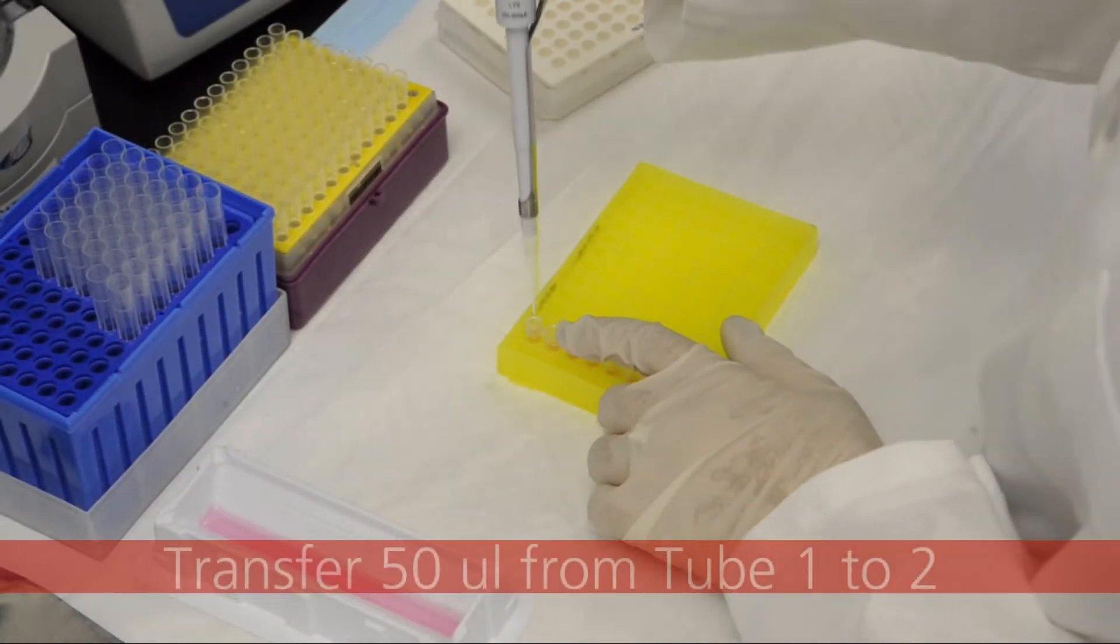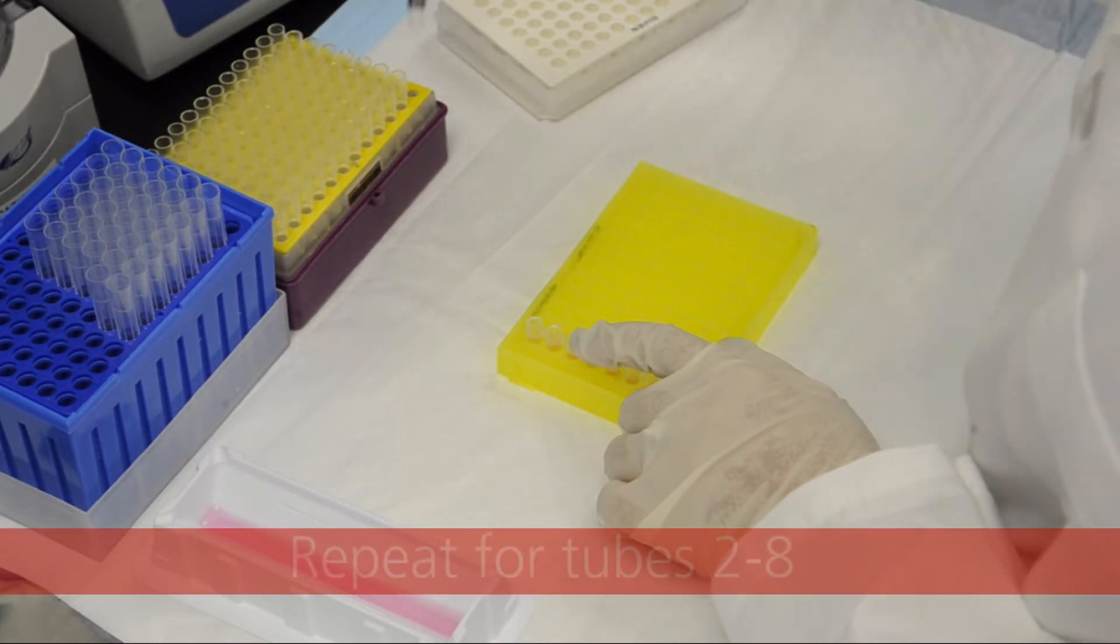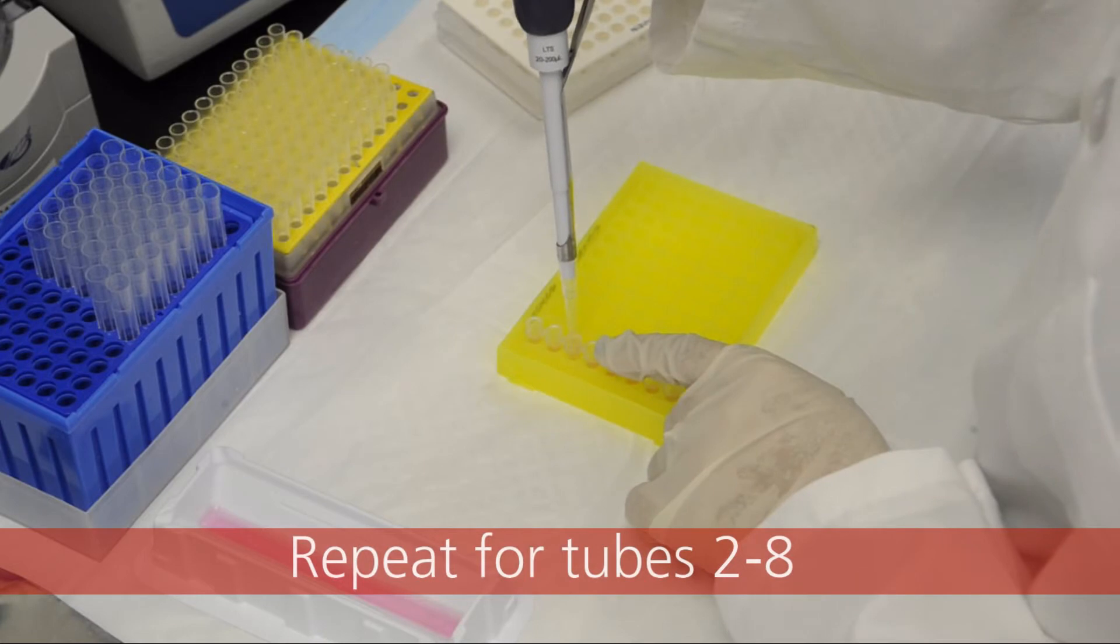Transfer 50 microliters from tube 1 to tube 2 and mix by pipetting up and down 10 times. Using a new pipet, transfer 50 microliters from tube 2 to tube 3 and repeat for the rest of the tubes.